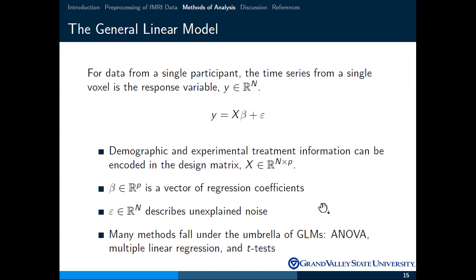And the predictors there, Andrew, are not time varying, right? They're just single values. Right, I think a single predictor value for an individual. They're not varying in time, not typically, although some people do what's called task-based fMRI, where they have subjects do different tasks throughout the duration of the session, in which case that would change throughout time. Right, but most of the predictors would be like age, disease status, right?